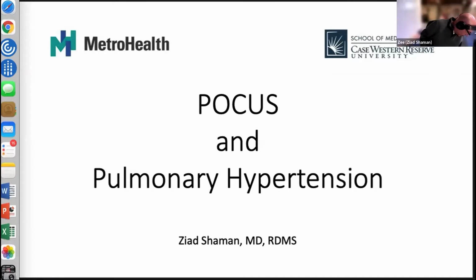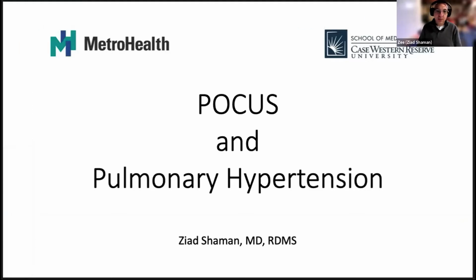Thank you, Matt. So I'll try to make it as useful to the emergency doc as much as it is to the critical care doc. I don't have any conflicts of interest, and I'll share that slide. The goal of the lecture, of course, is to talk about the usefulness and limitation of ultrasound measuring pulmonary artery pressure, to follow an algorithmic approach to assessing pulmonary hypertension, stratification of the pulmonary hypertension, and to understand the role of other imaging modalities in diagnosing pulmonary hypertension.